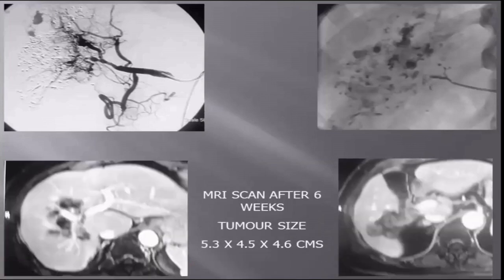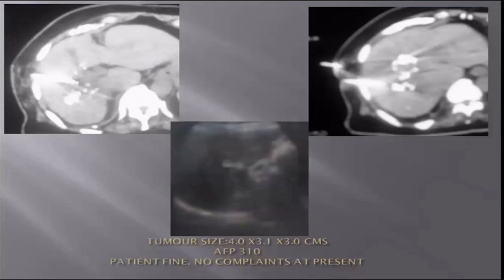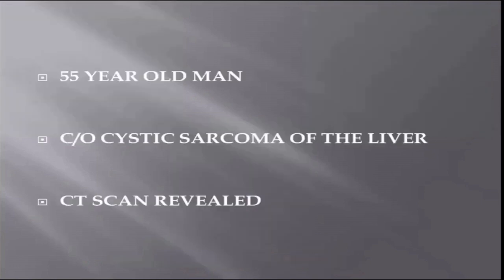And then mild liver and renal dysfunction occurred. So we did a plain MRI, which also showed a lesion. And then we did RF of the lesion, and we got it down to pretty much control. And we controlled the lesion for a long time till the patient passed away due to just old age and lived with this lesion pretty well. Obviously, that was a very nice case.